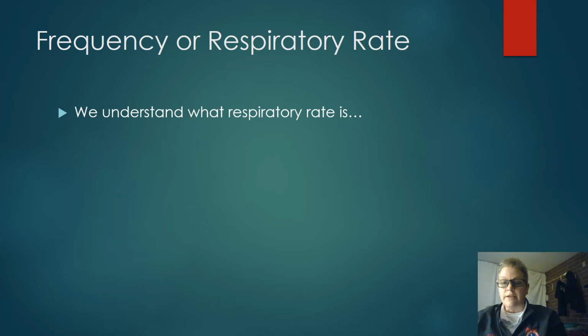So we're not doing any good with just using crash ventilator settings. I didn't know that, but I'm educating myself, and I'm trying to help you guys see this as well. So lung protective strategies with our tidal volume and our rates are going to help us keep our minute volumes and our alveolar ventilation up.